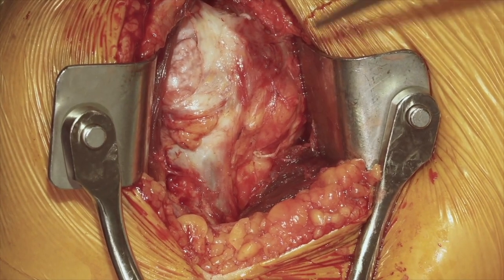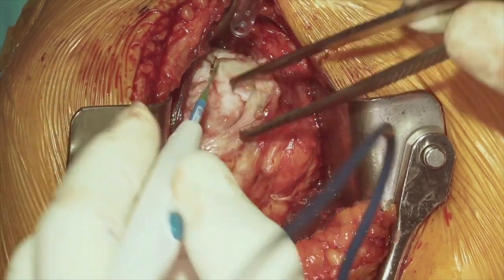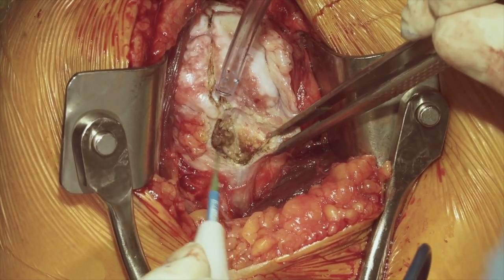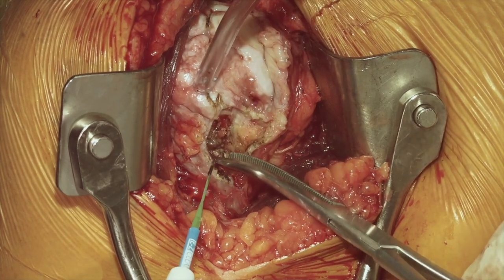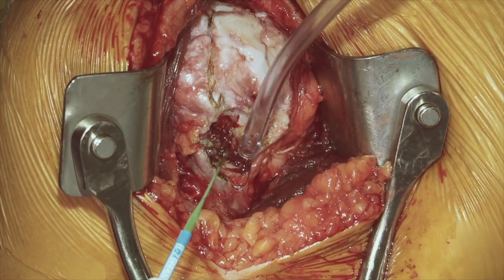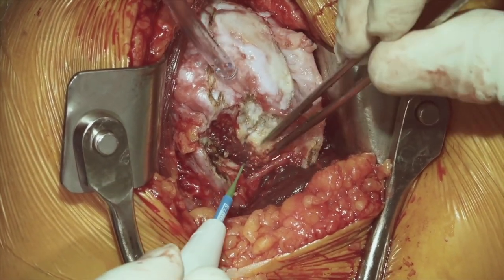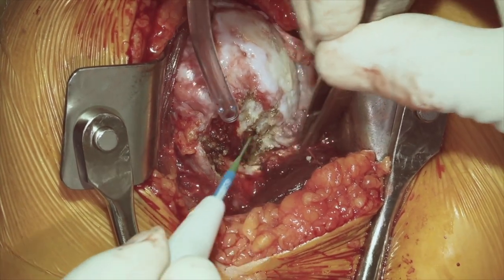The subscapularis is deficient superiorly, but we can still find the bicipital groove and proceed through the rotator interval. With our reverse prosthesis, we routinely perform a peeling of the subscapularis or whatever tissue is available directly off of the lesser tuberosity. There is some controversy as to whether the subscapularis needs to be repaired at the conclusion of surgery. Certainly, if we have a good subscapularis our plan is to repair it to provide some function anteriorly. But in cases like this where the subscapularis tissue is highly deficient, most likely at the end of the procedure we will not be repairing the subscapularis, as this tissue is not going to be functional and it may cause a contracture. The reverse prosthesis is designed to stabilize the shoulder even without the subscapularis being intact.